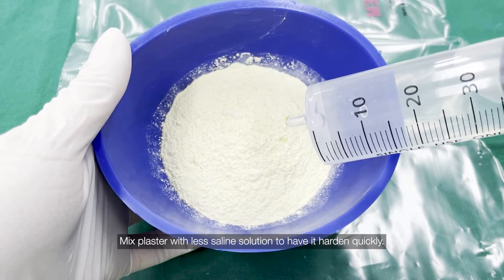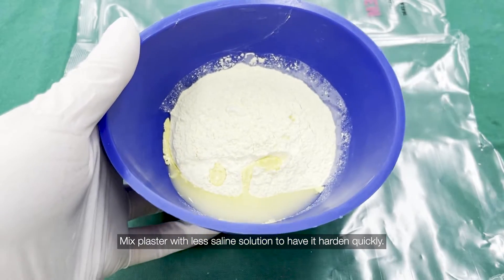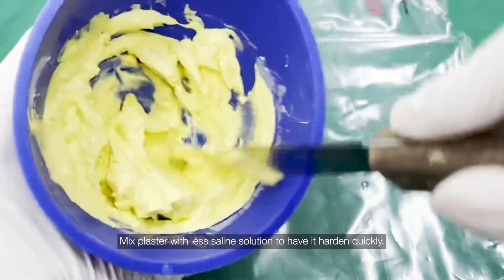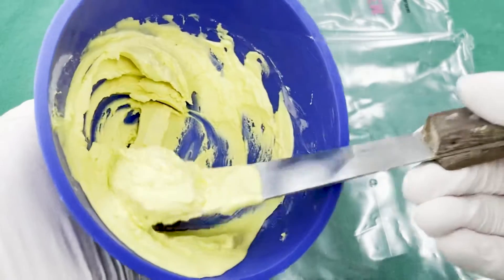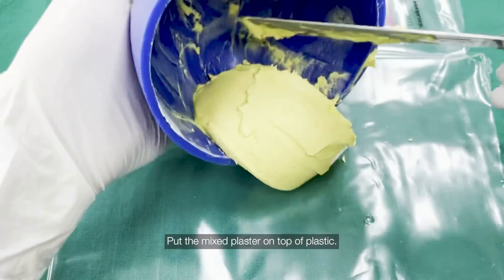Mix plaster with less saline solution to have it harden quickly. Put the mixed plaster on top of plastic.